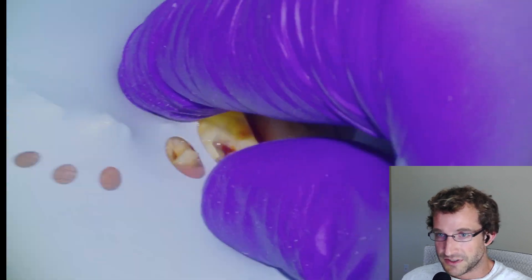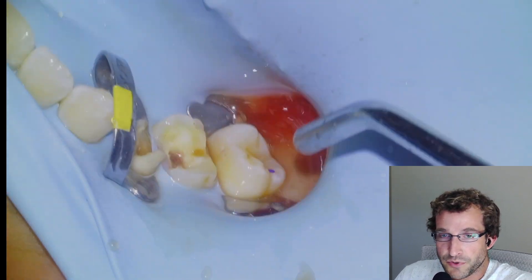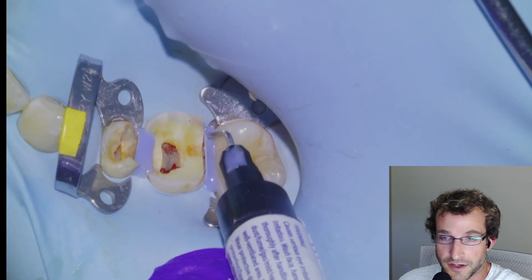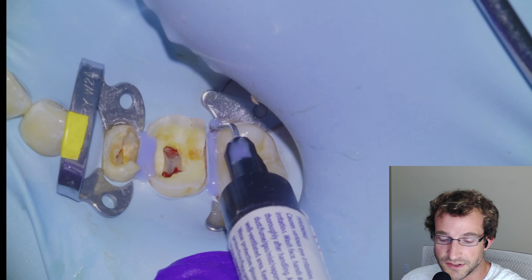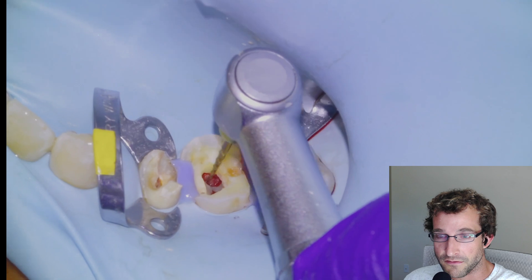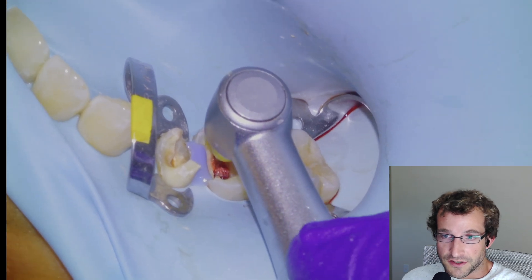I'm going to get the rubber dam on. We froze with one in 200 arcticane, then isolate the quadrant and I'm going to put another clamp on the 5 just for better isolation. I forgot to start the recorder while I was doing the accesses, so this is cutting in at the point of isolation when I realized the camera wasn't on. So we did the accesses as you can see and the occlusal reduction of the 1-6 and the 1-5.